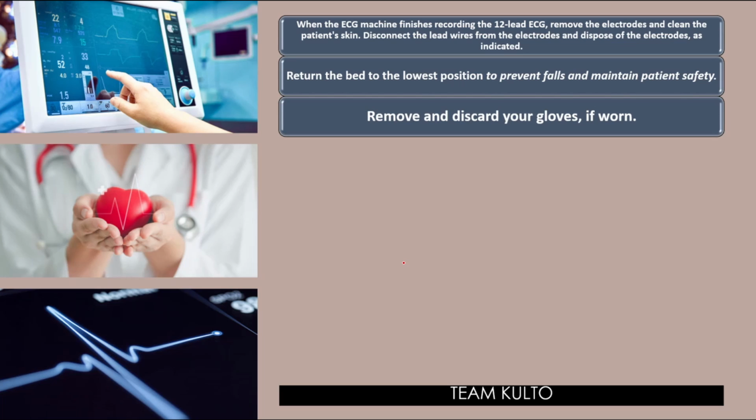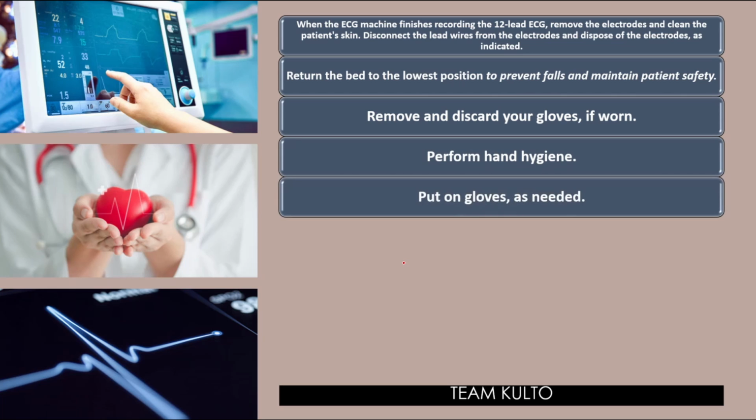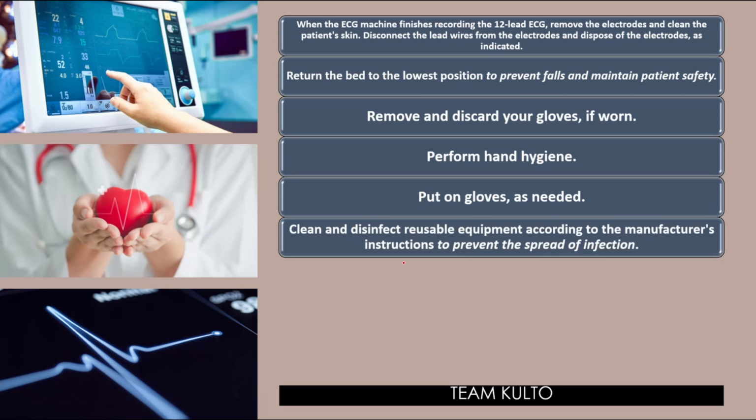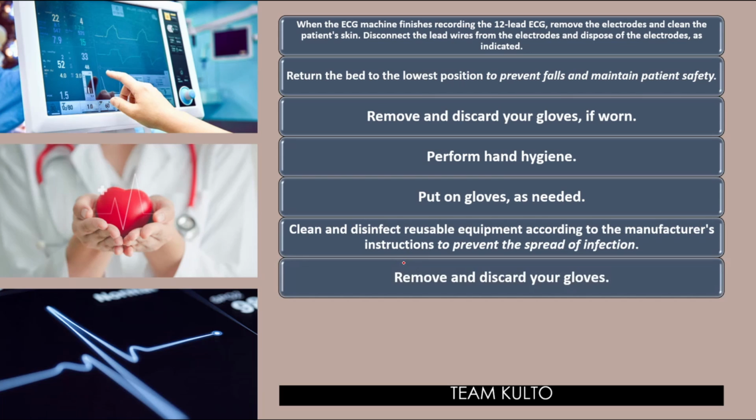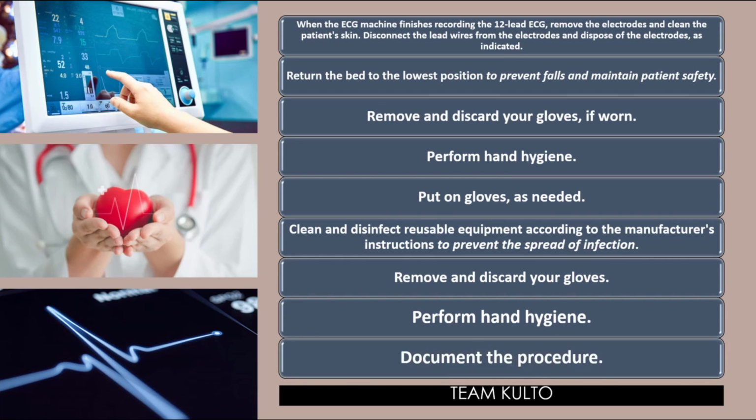Remove and discard your gloves if worn. Wag mong dalhin hanggang lunch, cafeteria ang gloves mo, girl. Perform hand hygiene. So, nag-hand hygiene ka sa umpisa, nag-hand hygiene ka rin pagkatapos. Put on gloves as needed. Clean and disinfect reusable equipment according to the manufacturer's instructions to prevent the spread of infection. Remove and discard your gloves. Very important. Perform hand hygiene. Paulit-ulit na naman tayo. Document the procedure.